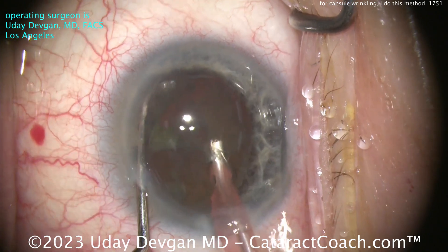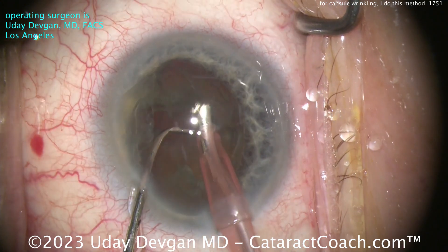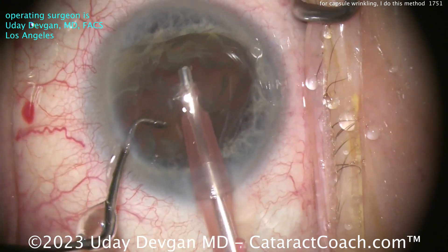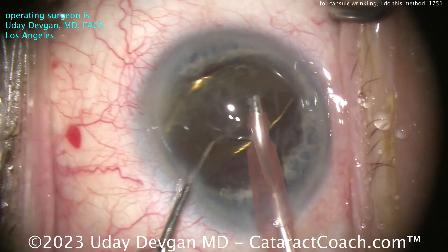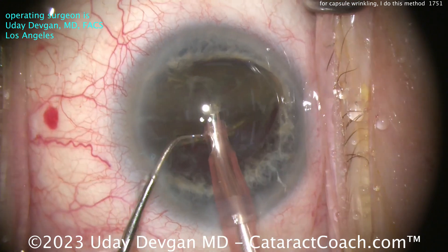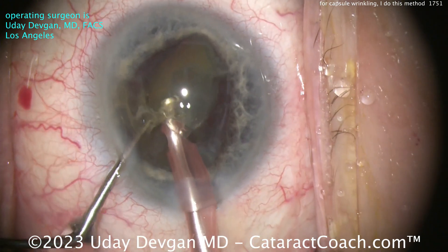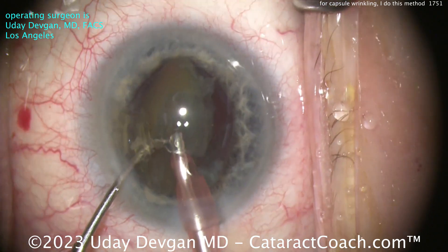Let's try again — get the chop around, maybe a little better, but still haven't broken off a big enough piece. Let's try again. Notice the tenacity — I'm not giving up, no chance, no way, no how. More aspiration. We didn't get that first chop we wanted — that's okay. I'm keeping the nucleus tilted to the side. Let's try a Lindstrom tilt-and-tumble technique, or perhaps I could finally get the chopper around. Let's see — can we finally split it? Not really.